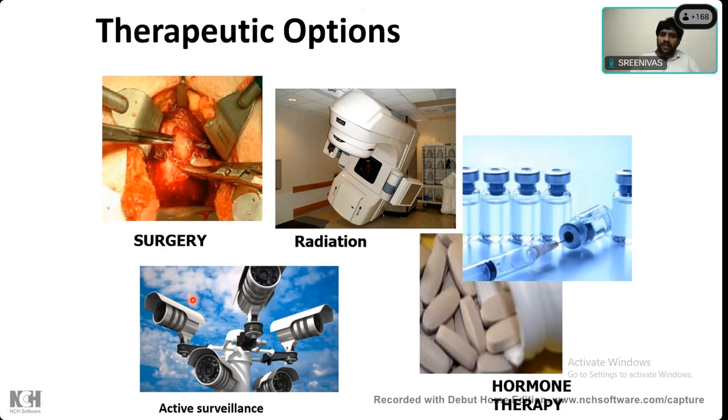After 5 years, how much was the patient like? What do you mean by active surveillance? Some patients are placed on active surveillance. Followed up, yes. No treatment, regular follow-up. So it's not actually just following, we are actively following up the patient. In the sense, if the PSA rises or if you think that the grade of the tumor is increasing, you need to do PSA velocity or something during active surveillance.